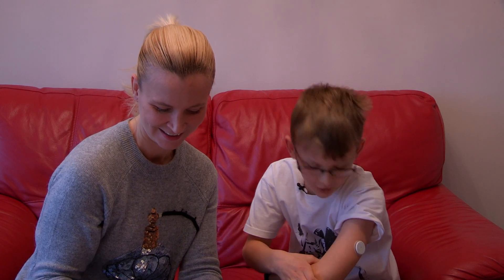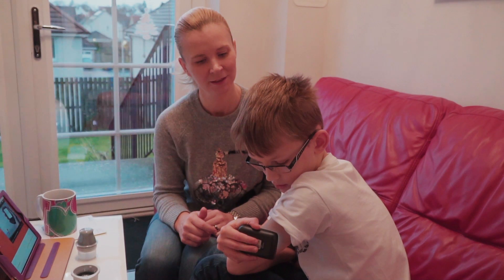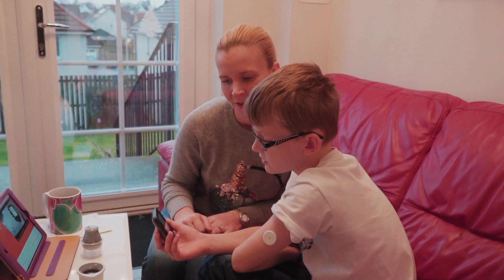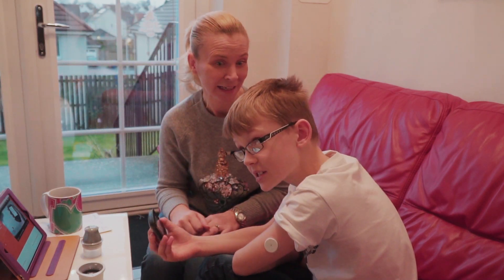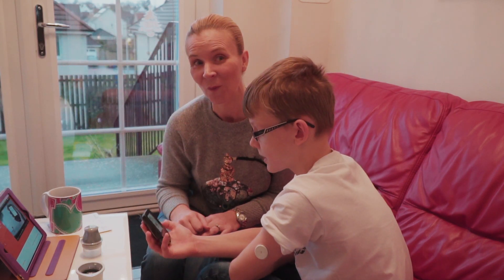All that's left is to start the sensor. The video said to press the blue home button, then tap 'start new sensor.' Doing that — new sensor starting up. The sensor can be used in an hour's time. We're going to fast forward an hour and then take our first reading.